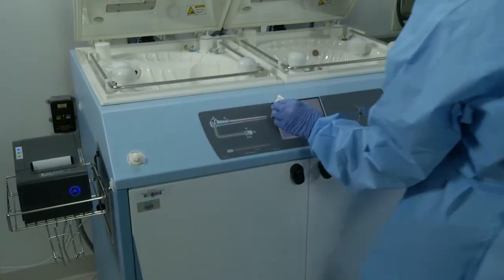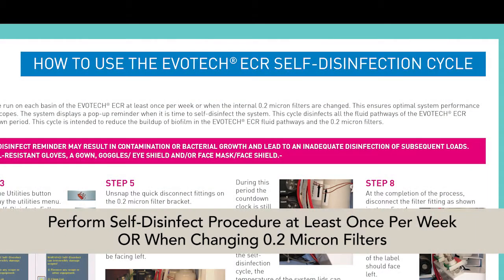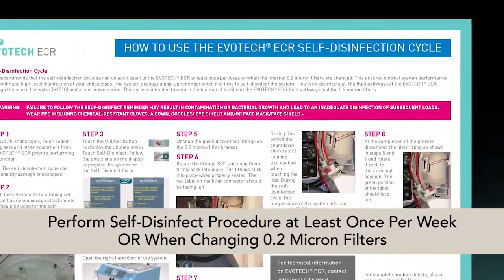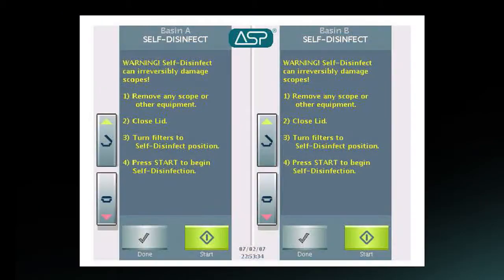Then leave the system switched on to reduce startup time for the next day. ASP recommends the self-disinfect procedure be performed at least once per week or when the 0.2 micron filters are changed. The length of time to run a self-disinfect in both sides simultaneously is approximately 2 hours. The EVOTECH will display a pop-up reminder when it is time to self-disinfect the system.